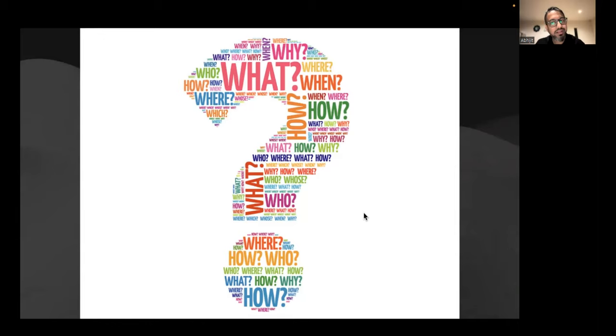Sometimes it might be a probe thing. I'm not sure, because sometimes we get so engaged with doing the scan that we put the probe in the opposite direction and think we are seeing the cranial end at the caudal end. So I think Abhijit has correctly alluded to the fact that it's a reflection of lung aeration.